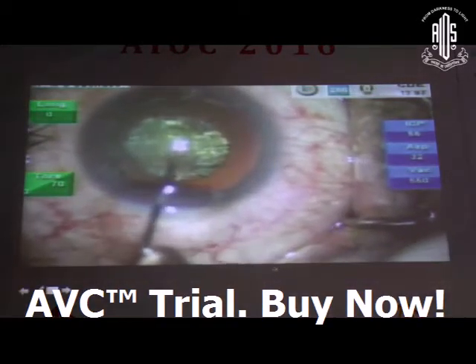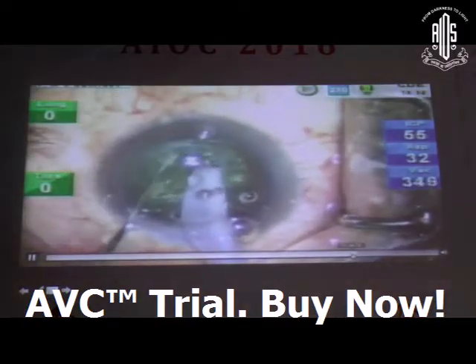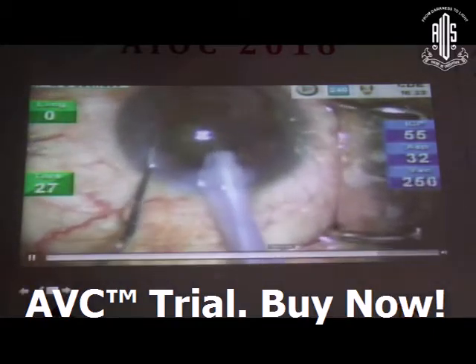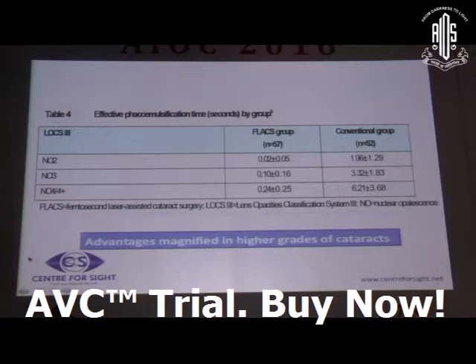So again, I'll just go towards the end. So you can see this is again very clear. You can just go ahead and do a gentle aspiration with very little phacoemulsification time. Now, the effective phacoemulsification time, when you go on to harder cataracts, that is where it comes down. So if you look at NS4, you can see that the phacoemulsification time in the conventional group versus the group that you have on femtosecond is significantly different and much more.